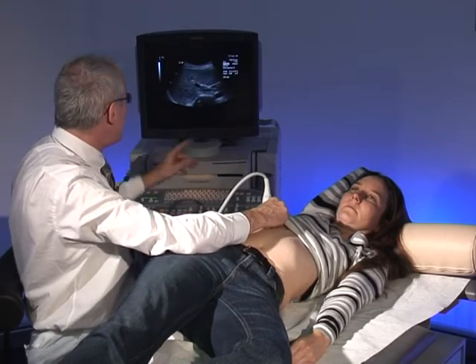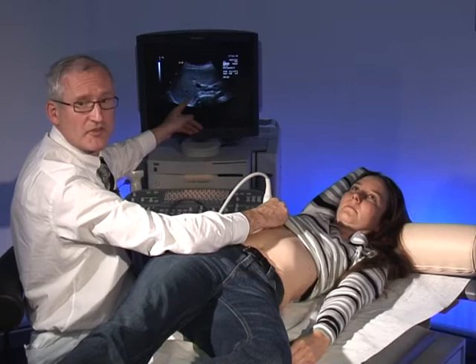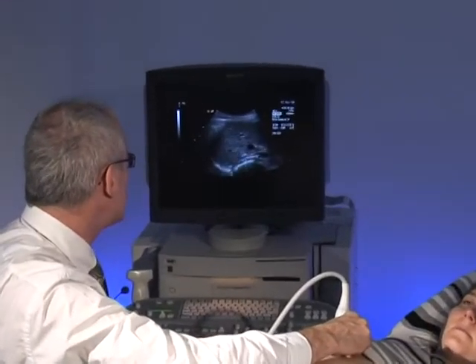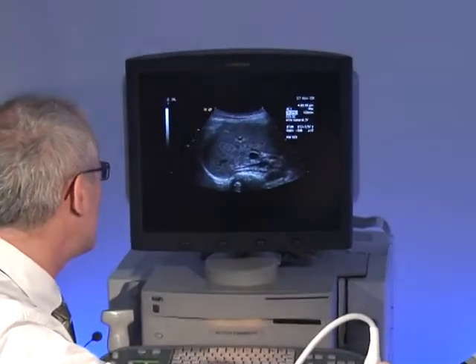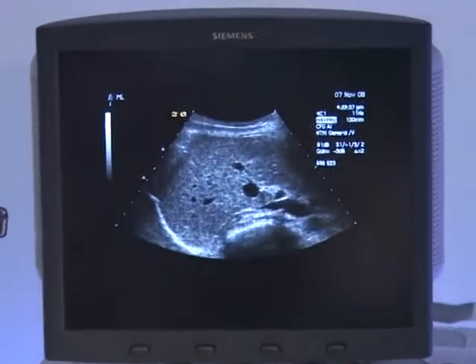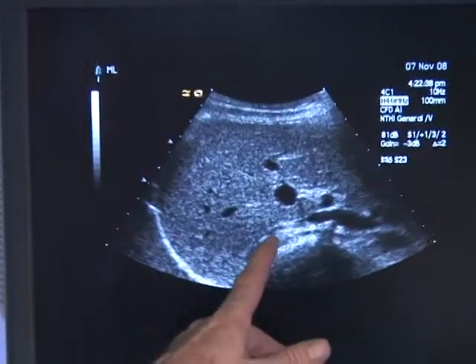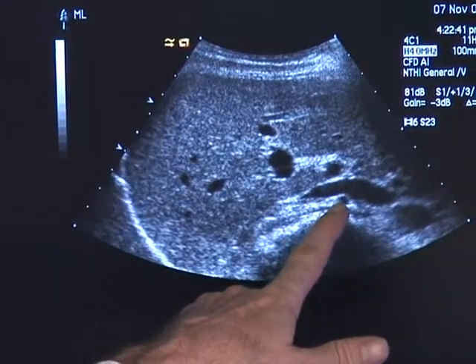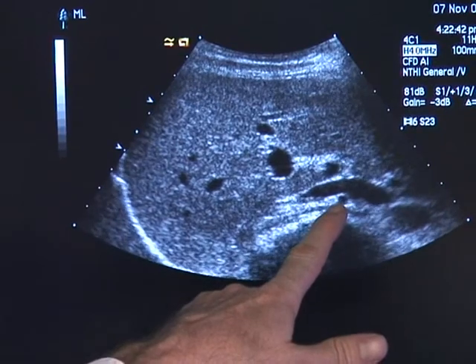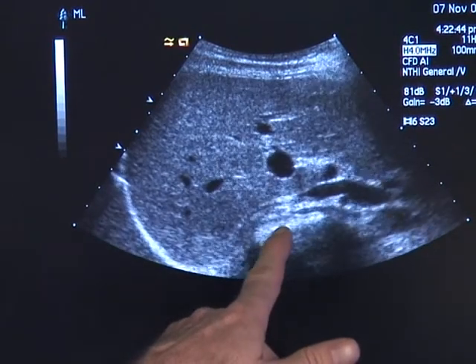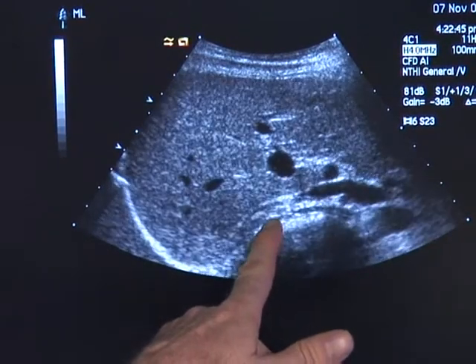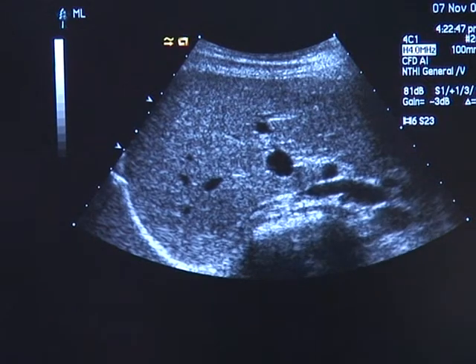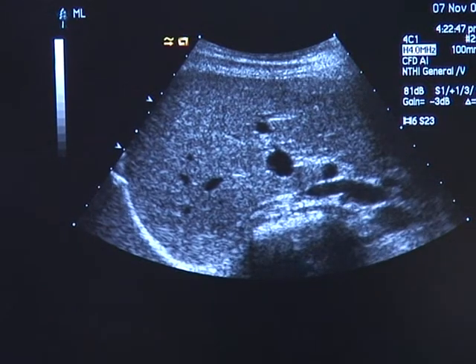Have a look now to the screen. Take a breath. Stop — don't breathe, don't move. Here you can delineate the inferior vena cava, right renal artery, diaphragm, and nicely the right adrenal gland.